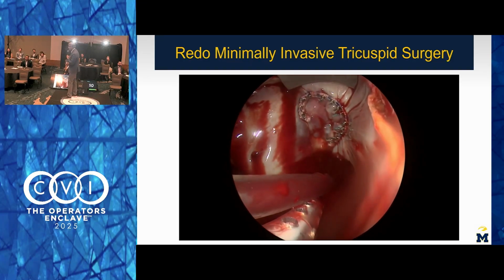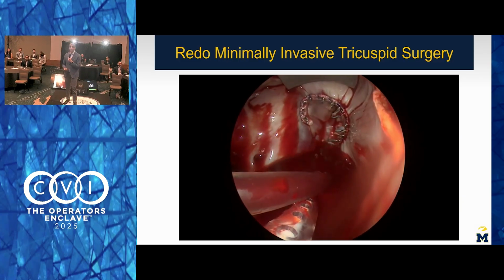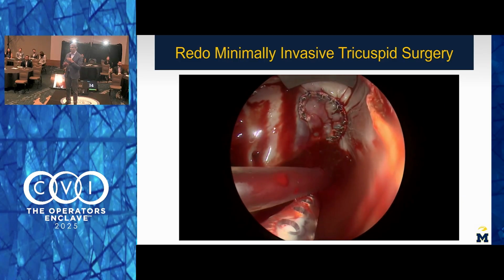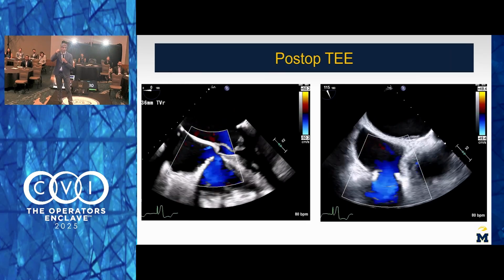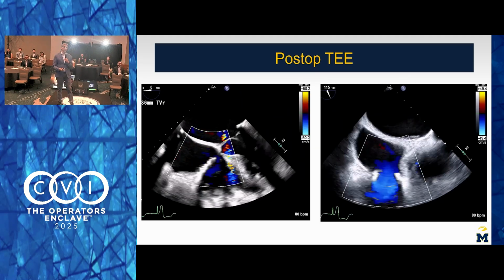We will oftentimes do an edge-to-edge repair, and so we went ahead and tested again, and you can see there's actually a lot more coaptation. It's completely different in terms of the sizing. And this is his immediate post-op echo. They were having trouble with that before.